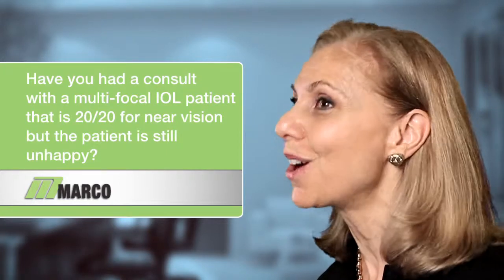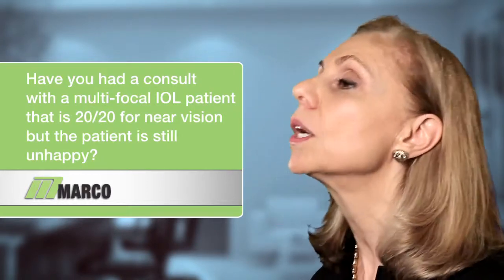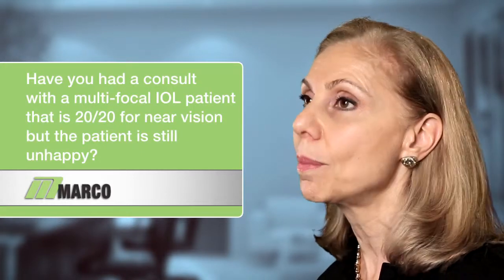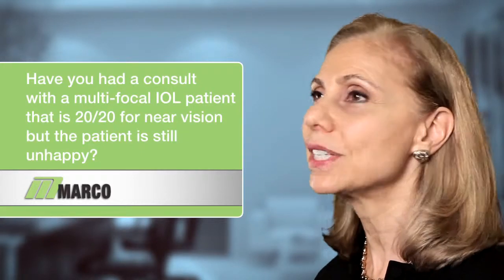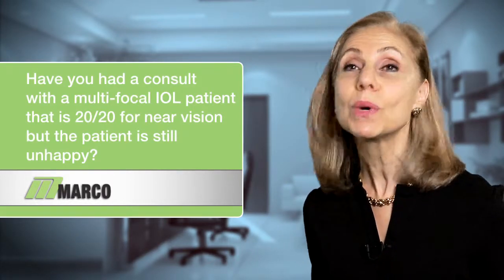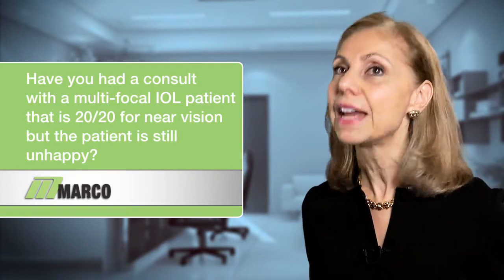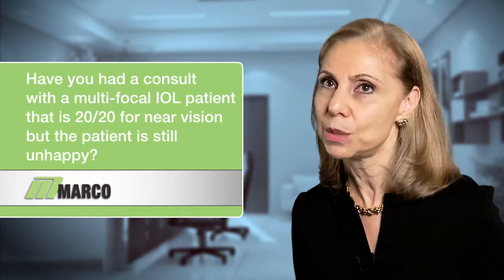After a lot of speaking with her and explaining this to her and showing her the maps on a large monitor in the exam room, she understood what was going on. We agreed to go ahead and do an IOL exchange, take out her multifocal and put in a monofocal, and after that, she said her life went back to normal. And what was surprising is in her fellow eye, she did not have a positive angle kappa. So she was not unhappy with a multifocal in her one eye, yet her angle kappa was so large in her second eye that it led to these problems.